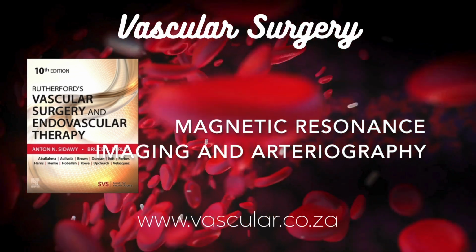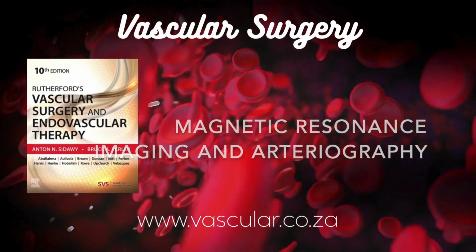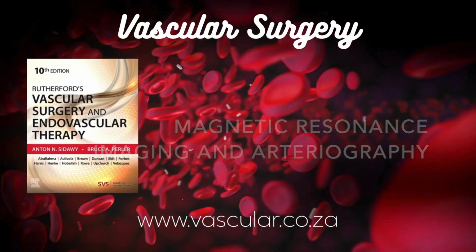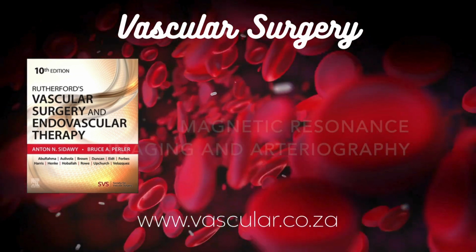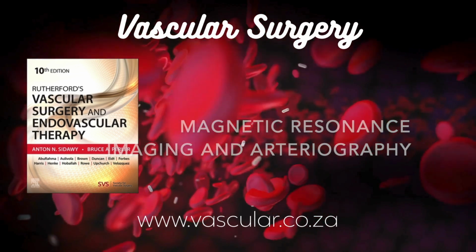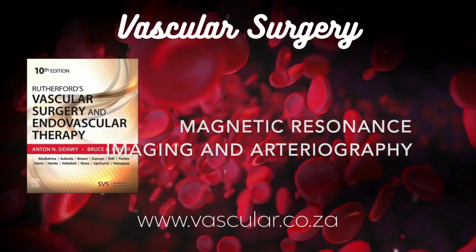Another class is based on ultra-small iron oxide particles, USPIOs. These have the added potential benefit of being safer in kidney failure patients and might also help image inflammation. Ferumoxytol is an iron supplement that's also a USPIO and has been used off-label for MRA in renal patients. Interesting. Staying in the blood longer sounds very useful.